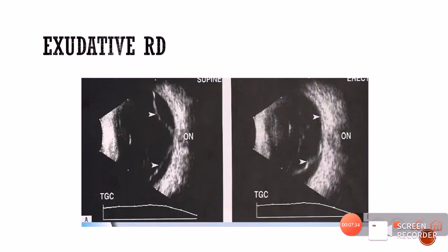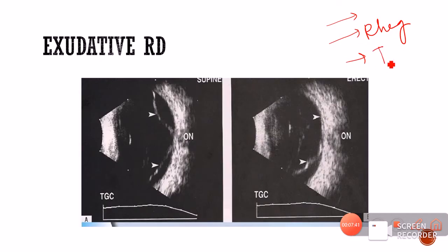Now, there are three types of RDs: the exudative RD, the regmatogenous RD, and the tractional RD. Let us see example B-scan images of each type of RD.